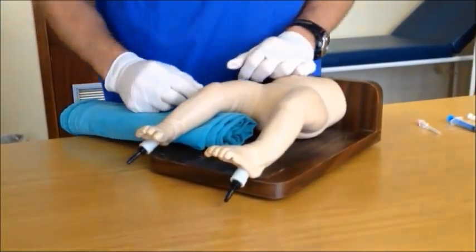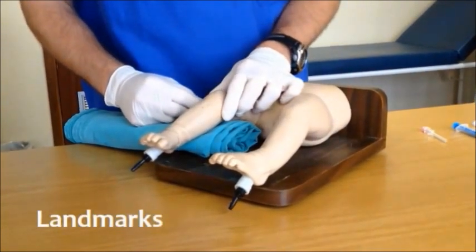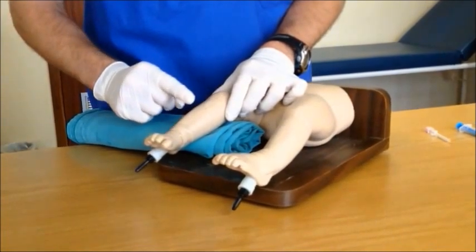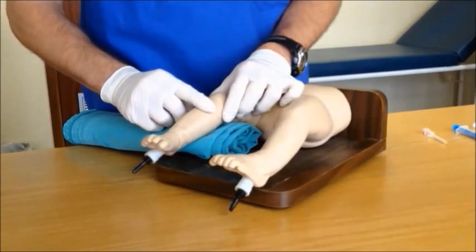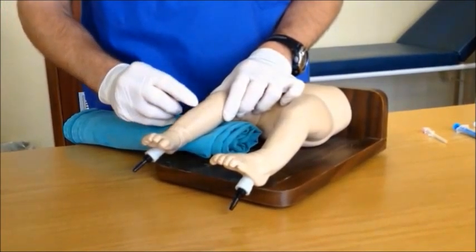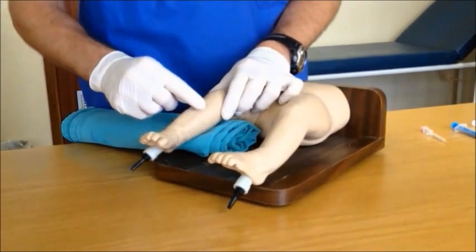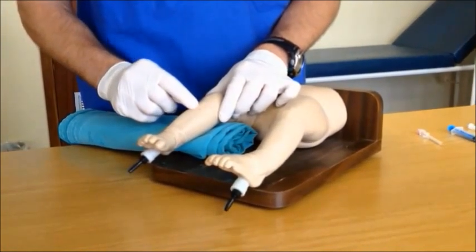The second step would be to identify the correct area of insertion. Grab the knee firmly and palpate for the proximal end of the tibia. The area that the intraosseous access should be gained is about one finger breadth distal to that on the anteromedial flat surface of the tibia. Please take care not to insert the needle too close to the knee, as damage to the growth plate may ensue.